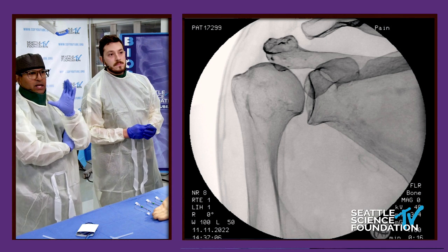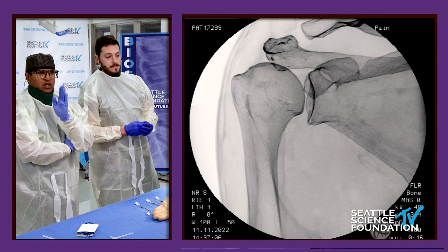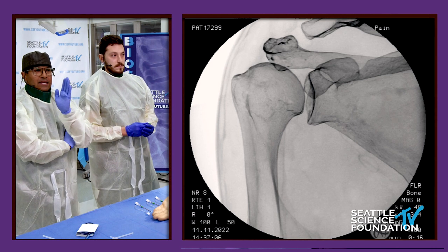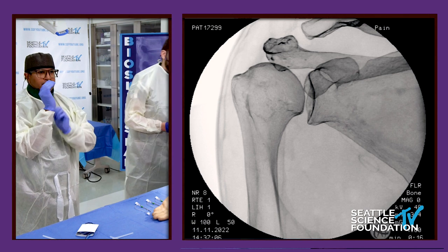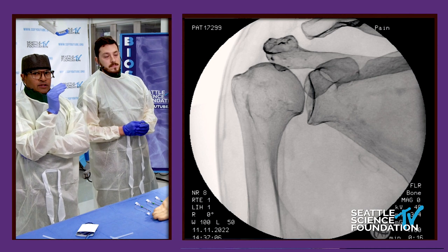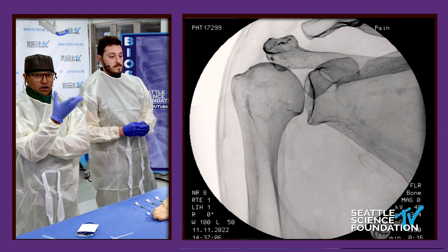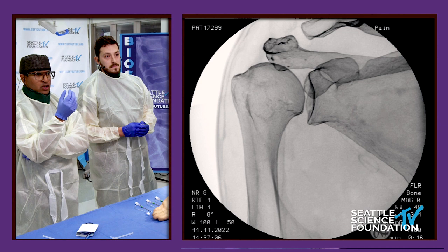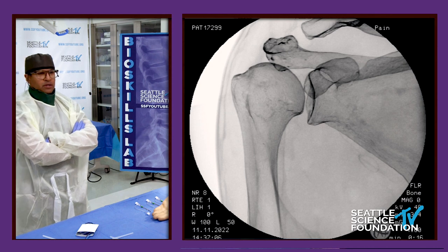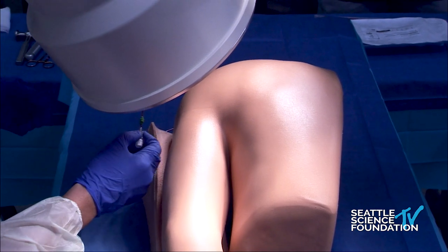So I think you can all appreciate the scapula itself. What we're going to do is locate the suprascapular nerve, which actually runs from a medial to lateral orientation along the scapula. The key thing here is to be close to the glenoid fossa, but not too lateral to be in the joint. If we're too medial, what can happen is you can cause a motor twitch, and of course we don't want to be radiofrequency ablating motor nerves. So there's a sweet spot, and we're going to show you that. Gavin's going to identify these two locations where we place two needles for the suprascapular nerve, and I've drawn out on the table where he should be going.